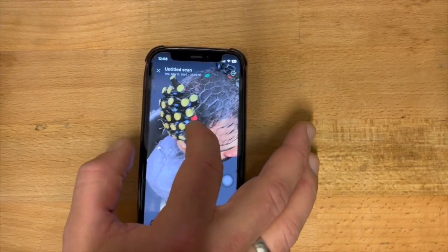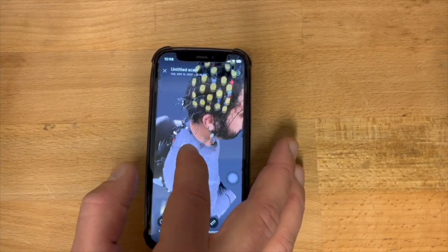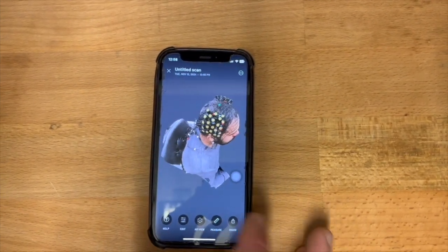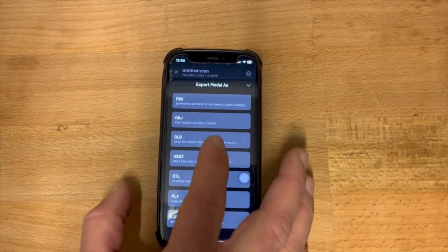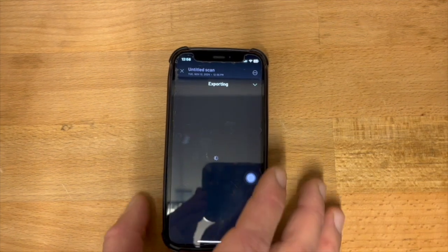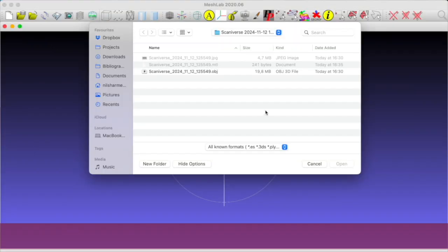If you're happy, export to OBJ as before, because it not only contains the point clouds but also the texture and the texture mapping, so that we can directly feed it into Cedalion. And then you're done. Let me also quickly show how to post-process the mesh.